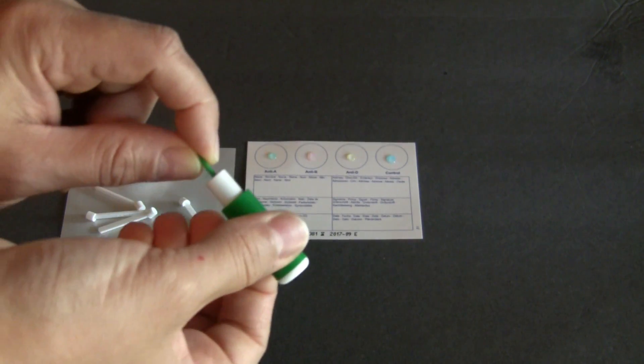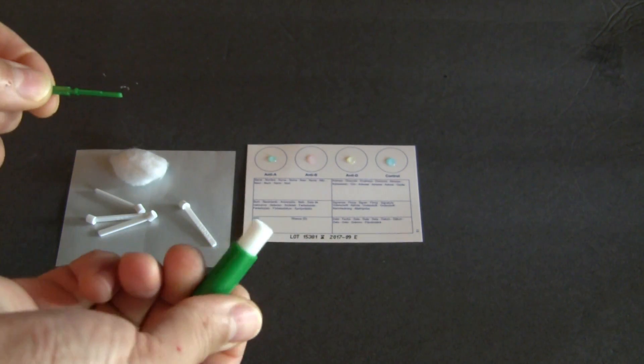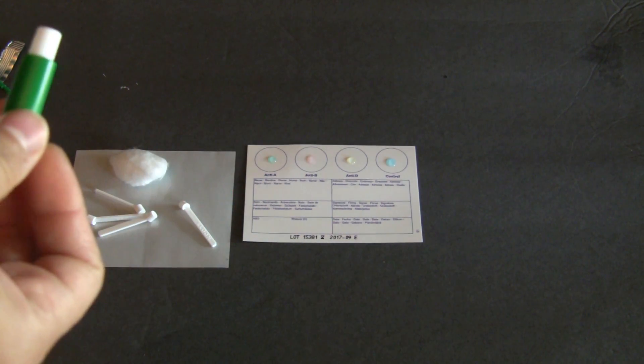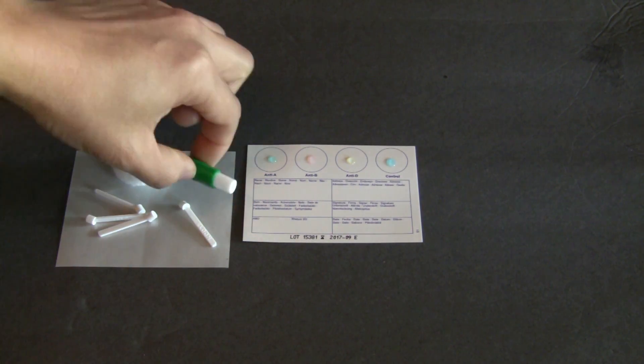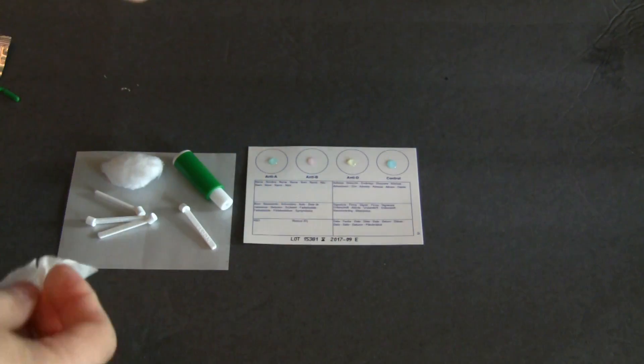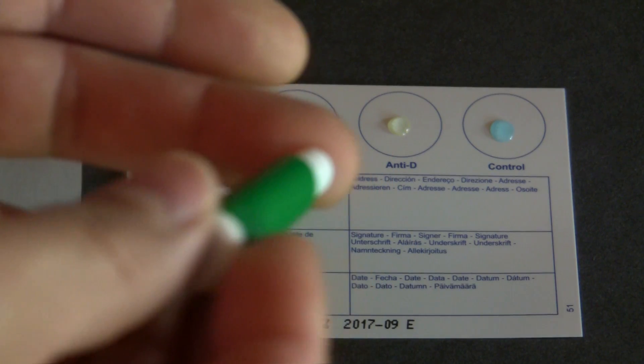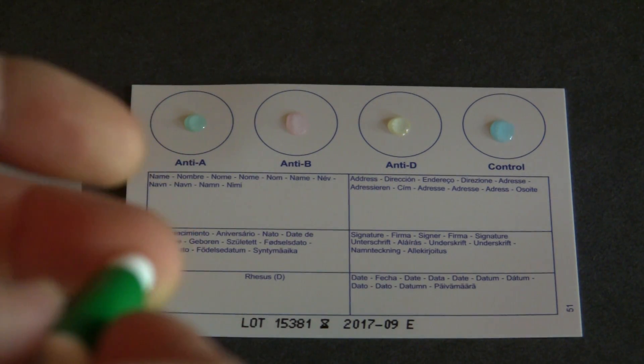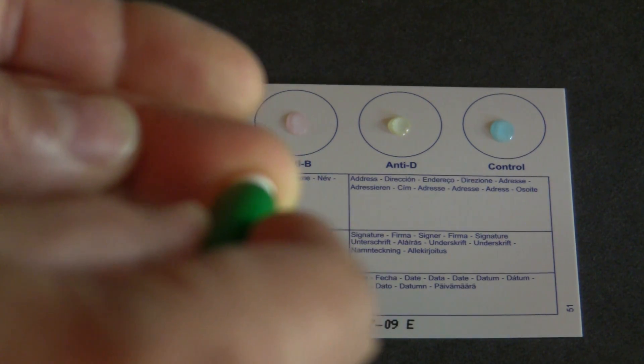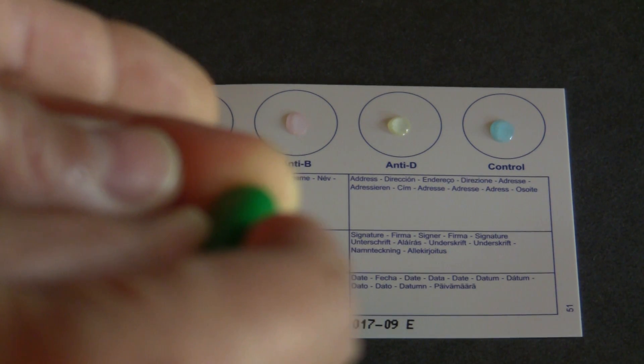So it says gently turn this and now the lancet is ready to prick your ear or your finger. And it says to do it closest to the pinky, so we're going to wait for it to click. And then it says to push once you hear the click.